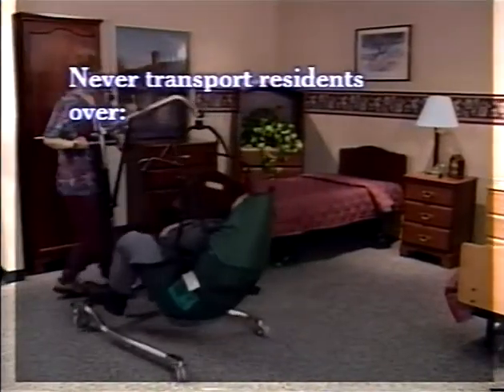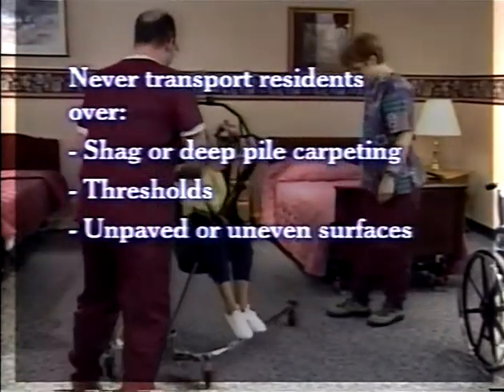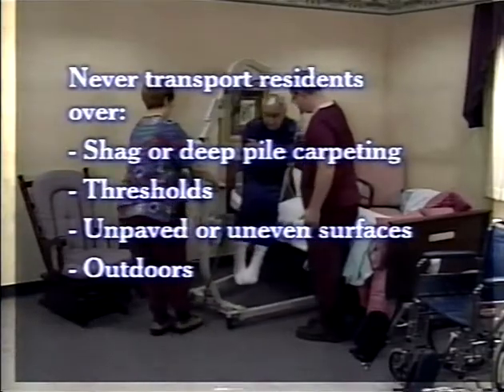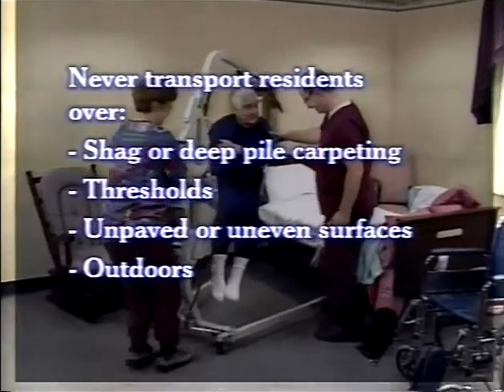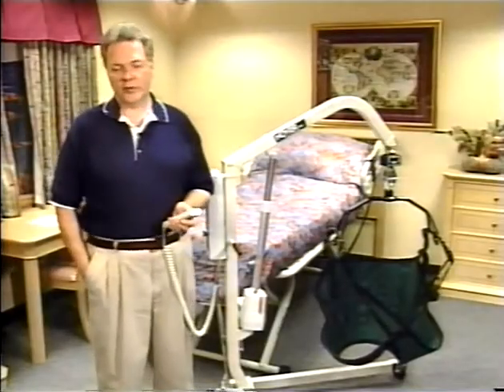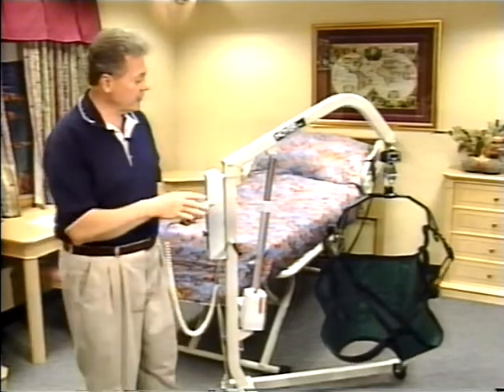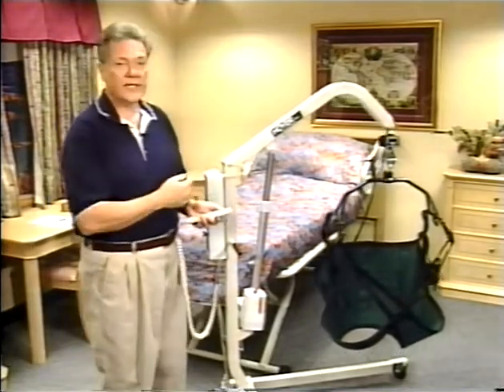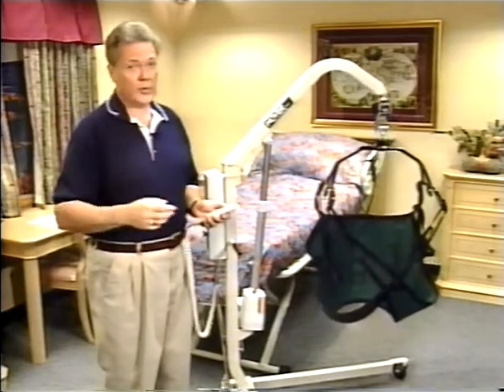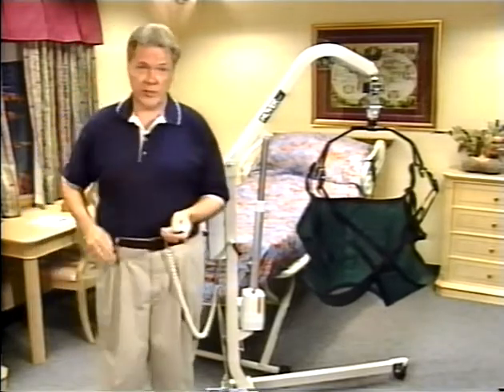Never transport residents over shag or deep pile carpeting, thresholds, unpaved or uneven surfaces, or outdoors. Forcing a lifter over an obstruction can cause it to tip or cause damage to the lifter. We recommend Hoyer lifters for transferring residents using proper methods and techniques. The strength of Hoyer lifters is their ability to lift safely and comfortably with little physical effort or risk to you or the person you're caring for. Transporting a resident calls for equipment better suited to that task.